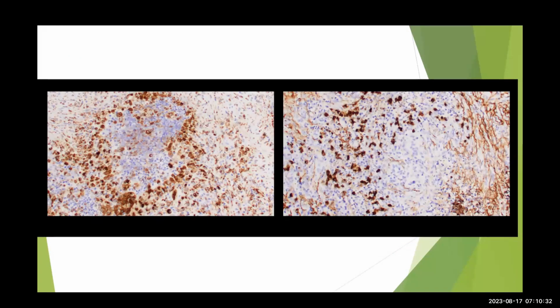So you can see on the left a beautiful picture of a necrotizing granuloma. The center is necrotic, and it's surrounded by histiocytes, macrophages, and a variable number of other mononuclear cells, such as lymphocytes. On the right side, we attempted an IgG4 immunostain to get the IgG to IgG4 ratio, to rule out or rule in IgG4-related pachymeningitis. There are some IgG4 labeling cells, plasma cells, as you can see in the center. Those chocolate dark round cells are IgG4-carrying plasmacytes.